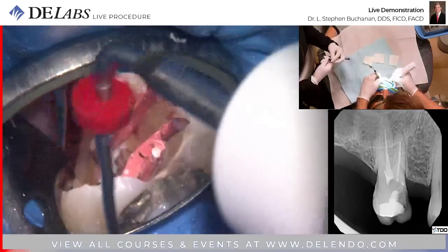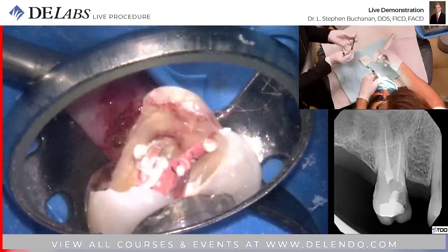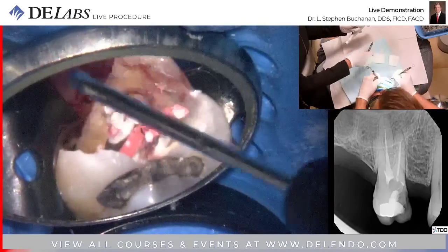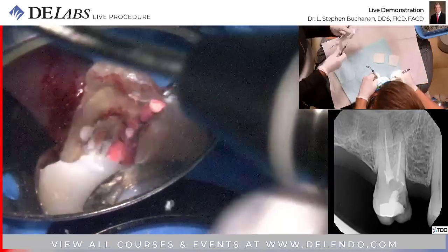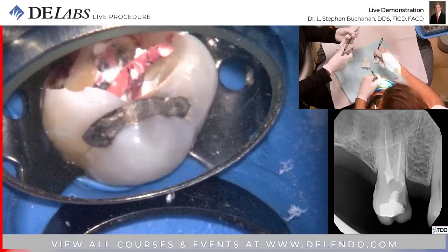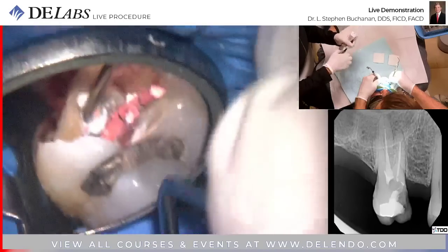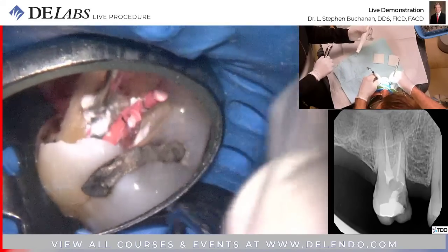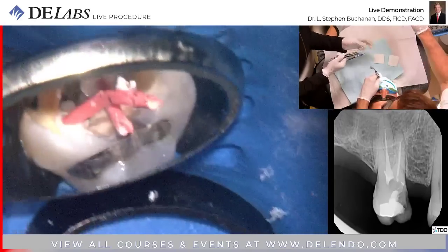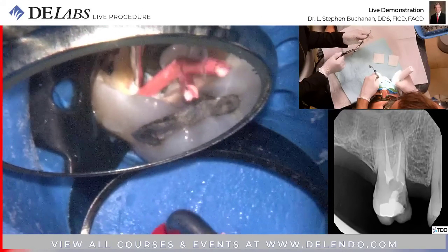This is the 0. And I'm not just cutting it, I'm adding heat. She's going to hand me the 90. I'll take the 70. As we start to cut these smaller shapes, even a millimeter is smaller than many of these orifice diameters. Okay, palpable. And I'm not condensing the MB yet, I'm just getting those out of the way.